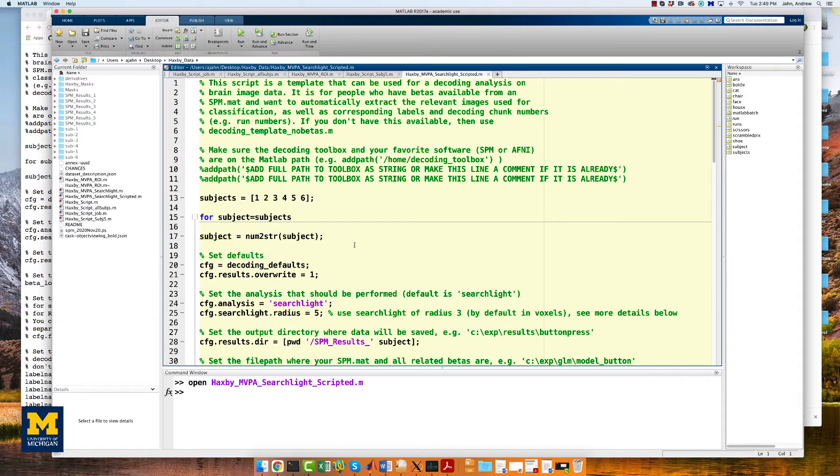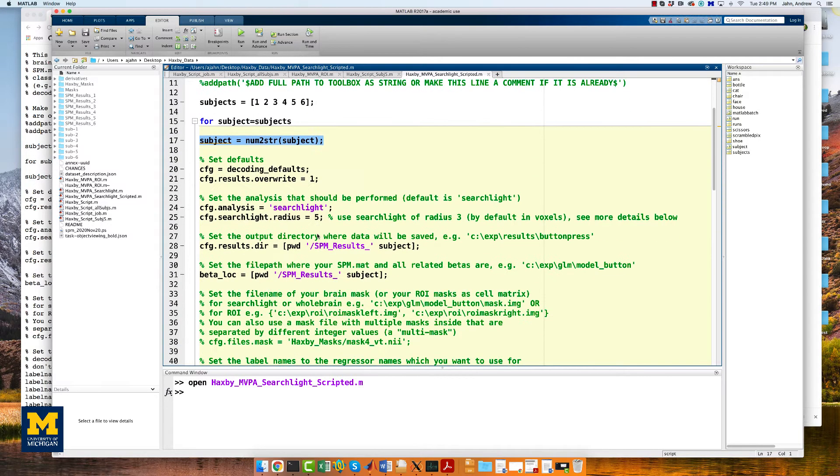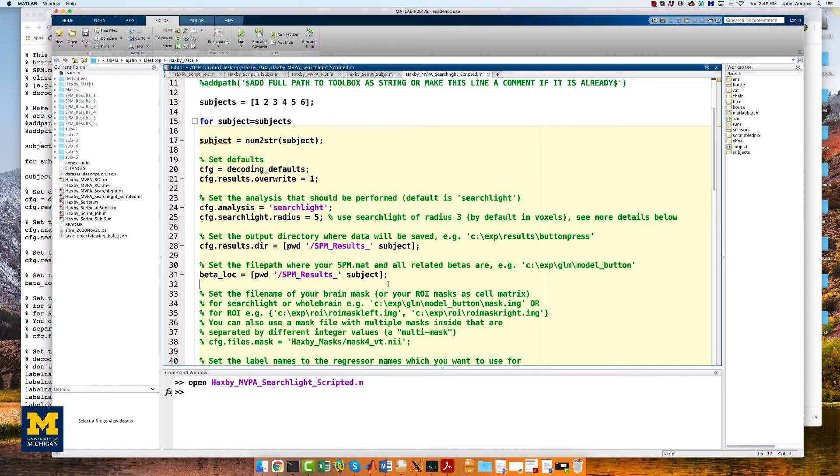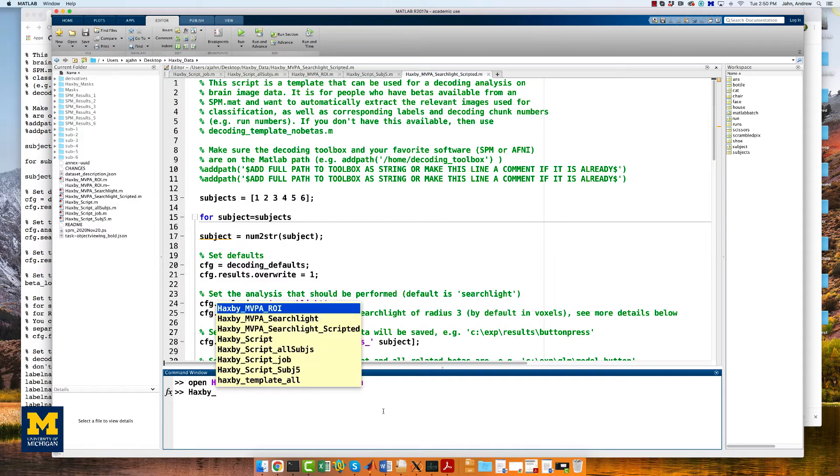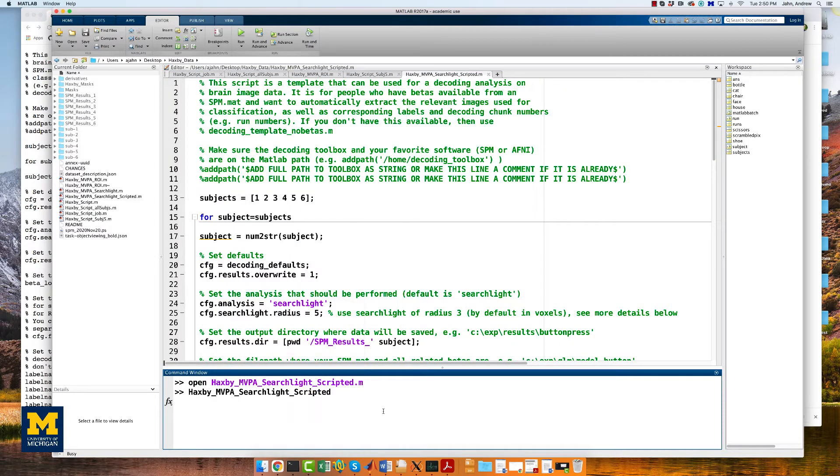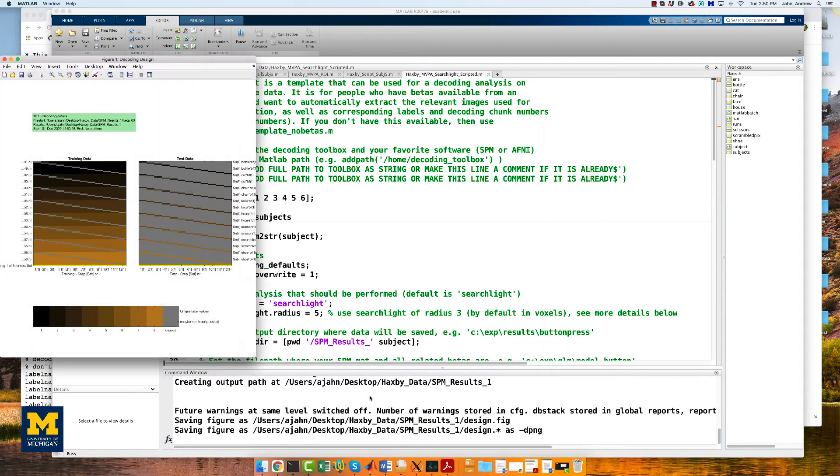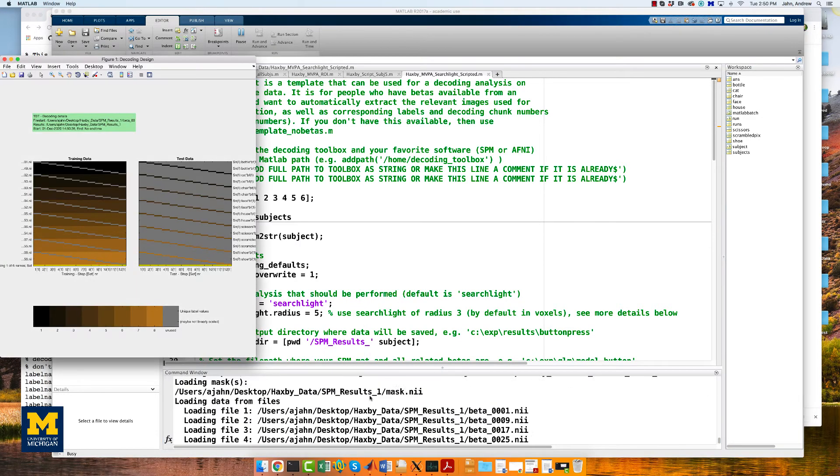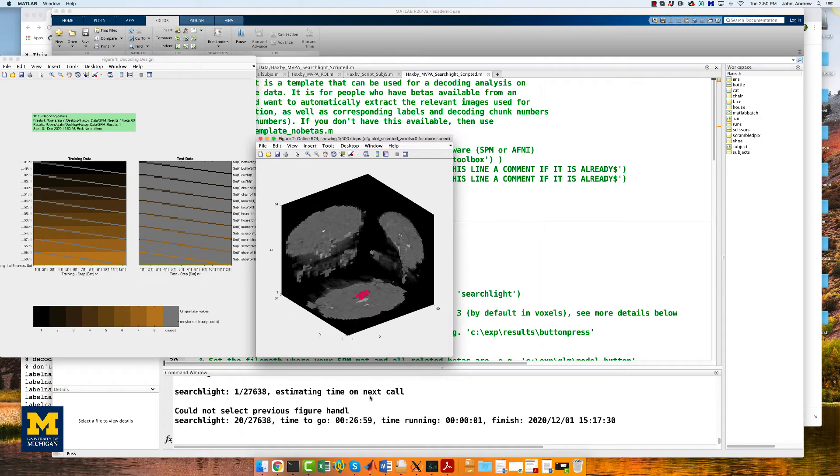Notice here we again have a vector of subjects, 1 through 6, and we have everything now within a for loop. Any time that we need to change a results directory or beta location directory, we use the subject variable. You can simply run this script, it's already been finished for you, and it will run the searchlight analysis for every subject. I'm going to fade out here and come back when it's finished.